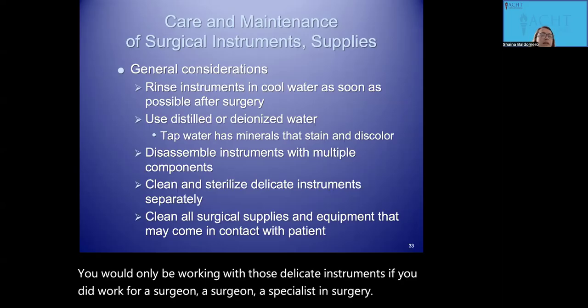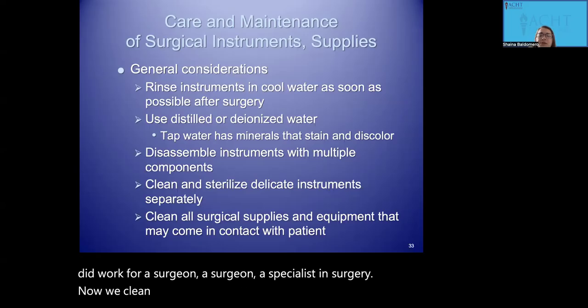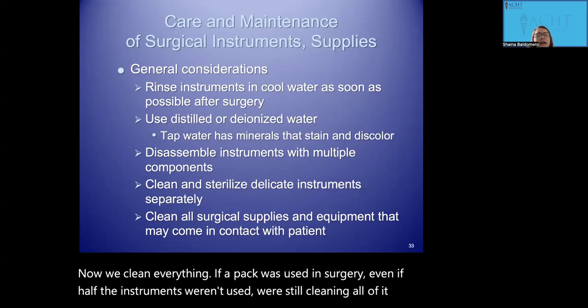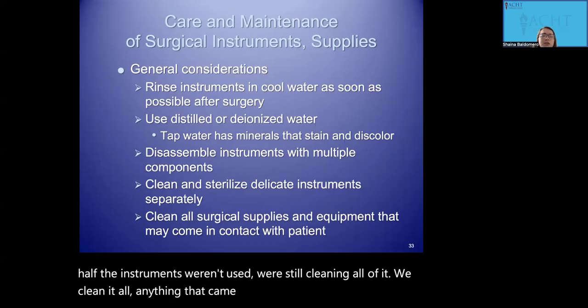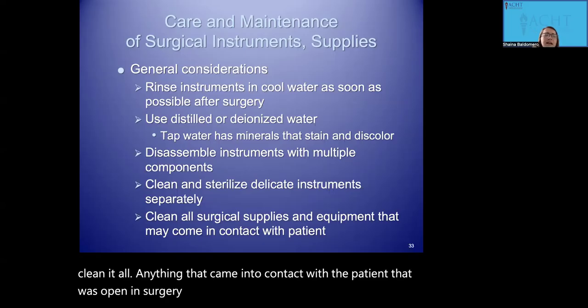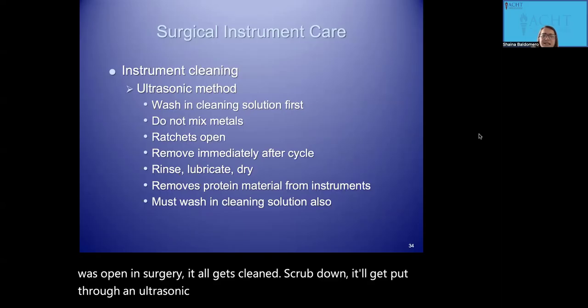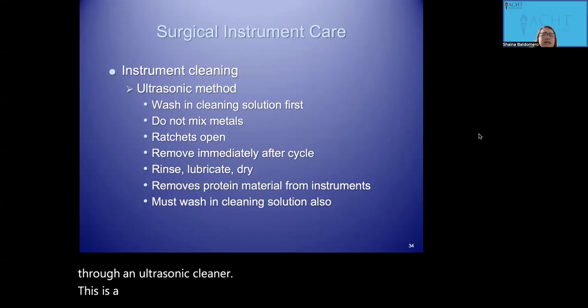Now, we clean everything. If a pack was used in surgery, even if half the instruments weren't used, we're still cleaning all of it. We clean it all. Anything that came into contact with the patient that was opened in surgery, it all gets cleaned, scrubbed down. It'll get put through an ultrasonic cleaner. This is an instrument cleaning method that is commonly used in the veterinary field.